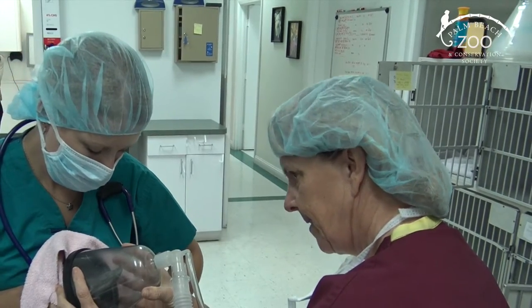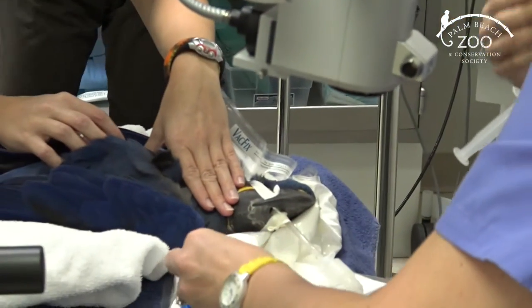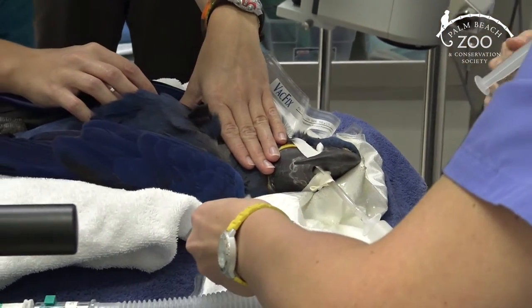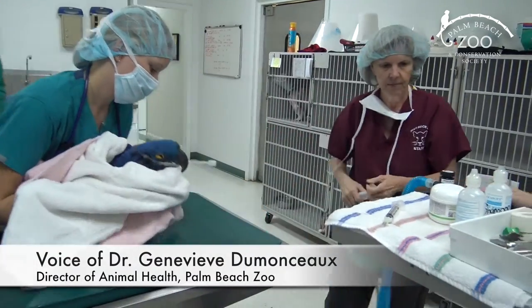Paris is being put under anesthesia. We use a big face mask over the beak first, and once Paris is all the way out, then we can put an endotracheal tube in to keep Paris down better for surgery.